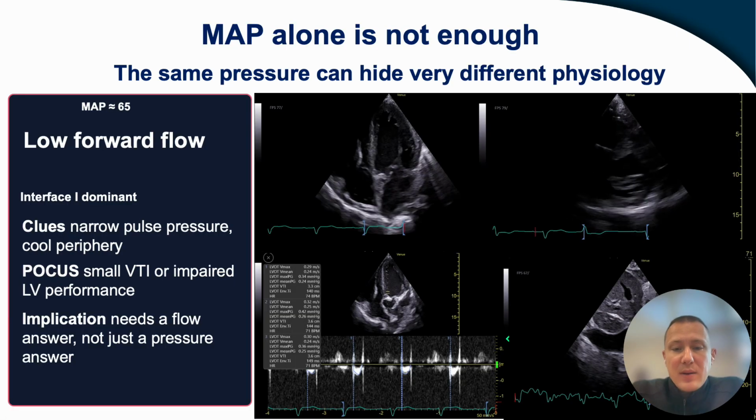So clinically, it would look like this. The patient would have low LV systolic function on the bedside echo. They would typically have very low forward flows as measured by LV-VTI right here. And the IVC would look pretty plethoric.